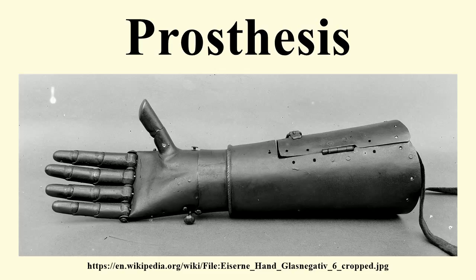Lower extremity prosthetics describes artificially replaced limbs located at the hip level or lower. In the prosthetic industry, a transtibial prosthetic leg is often referred to as a BK, or below-the-knee prosthesis. History. Prosthetics have been mentioned throughout history. The earliest recorded mention is the warrior queen Vishpala in the Rig Veda.